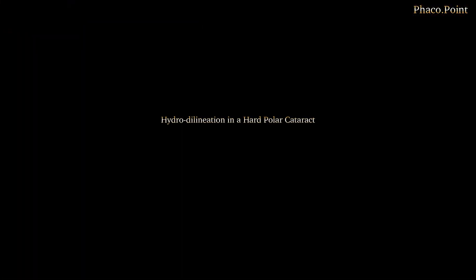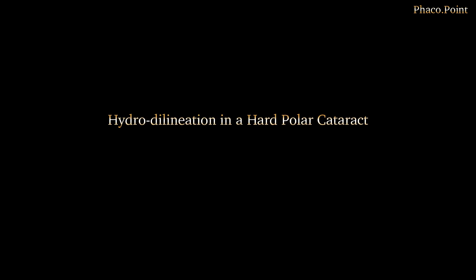Now let's move to seeing how you perform a hydrodelineation with care and caution in a patient with a cataract which is significantly more dense. Let's now move to watching the hydrodelineation in a dense polar cataract.